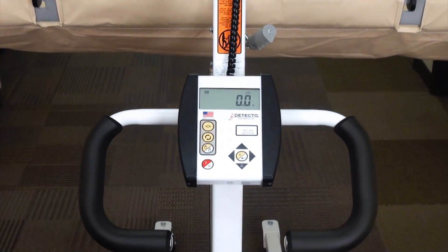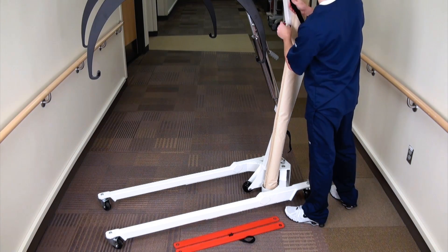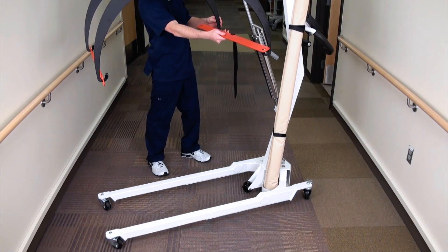This tares the weight of the stretcher. Remove the stretcher, roll it up, and secure it to the column once more while replacing the red transport bars.